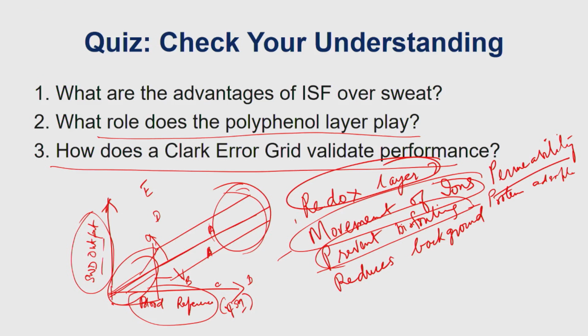What about sensors? Why don't we see them? It's early days. None of the sensors have gone beyond TRL stage 4. There's actually a new company that's come up, if you want to look for that, BioLinq, spelled BIOLINQ. It's by a student from Joe Wang's group, and it has been floated in the market. It's based on microneedles.